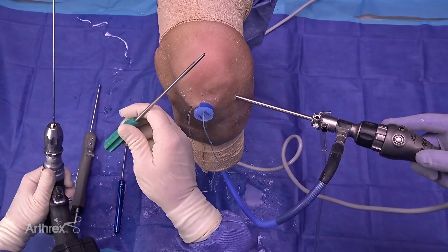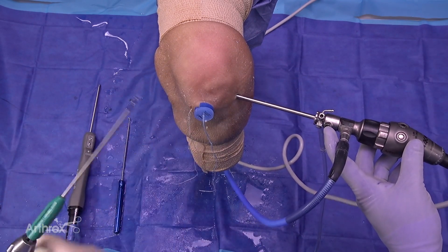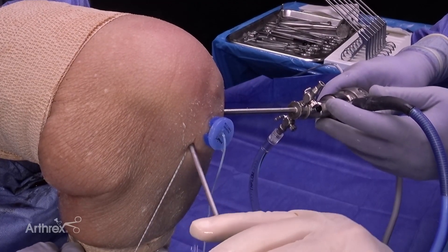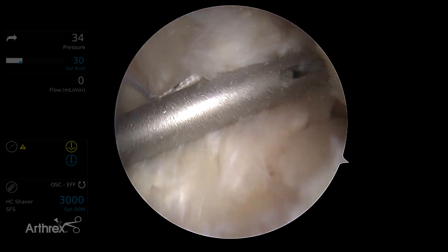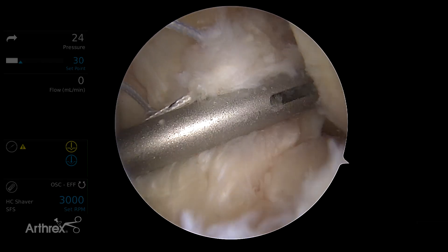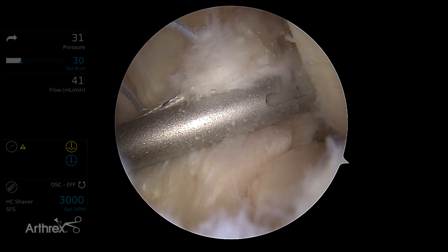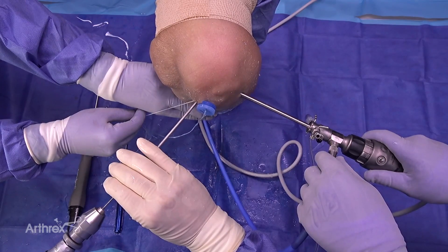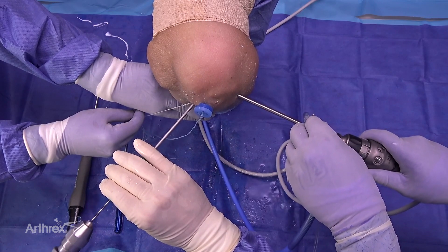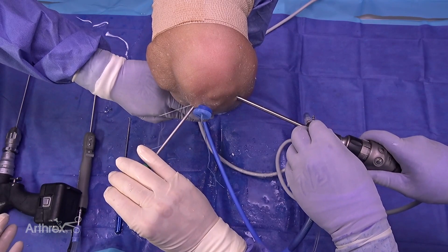We also have a drill sleeve so that we don't wind up the ACL while drilling. With the knee at 115 degrees of flexion, we bring the PL femoral footprint towards us. We take our drill sleeve, localize ourselves, and drill up with our 2.4 pin. We can bottom that out because we know exactly where we chucked to, so we're certain of depth.